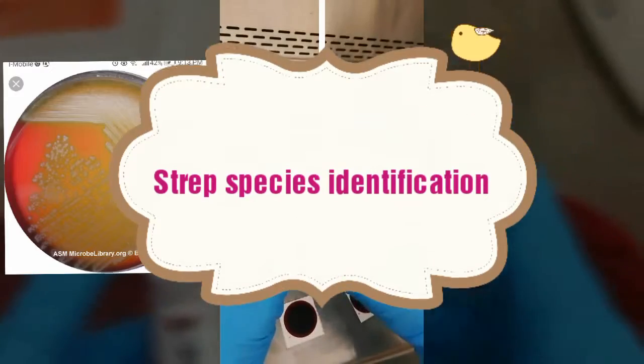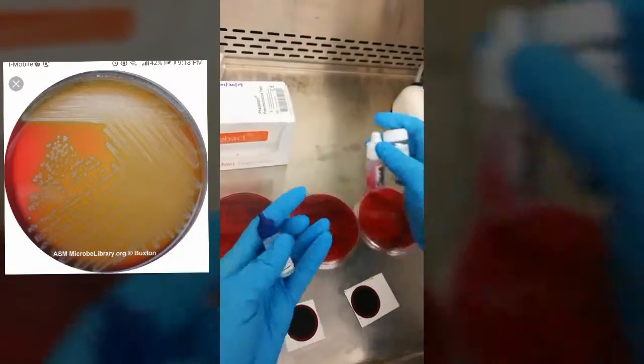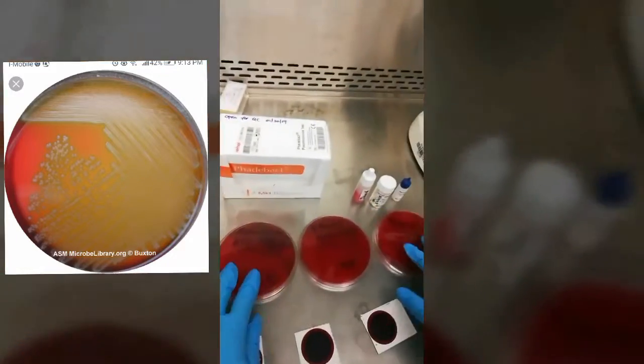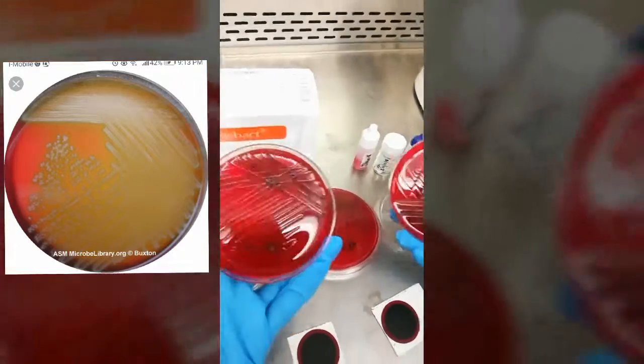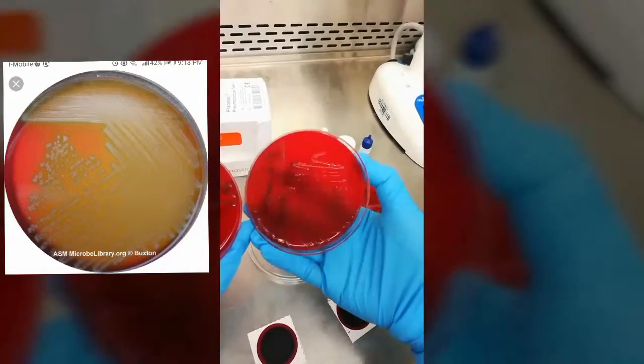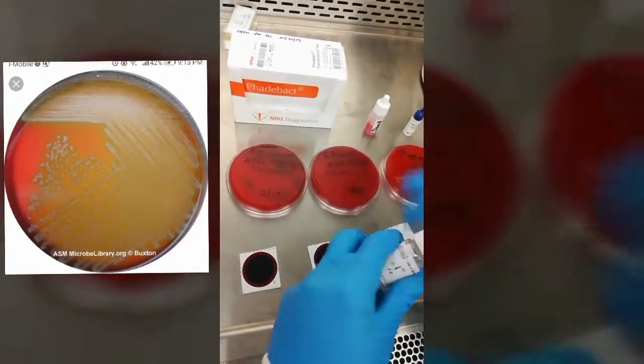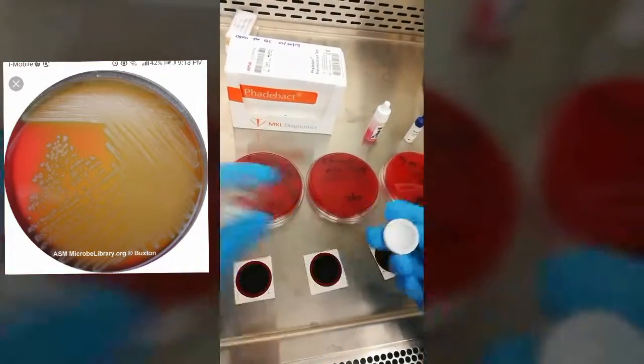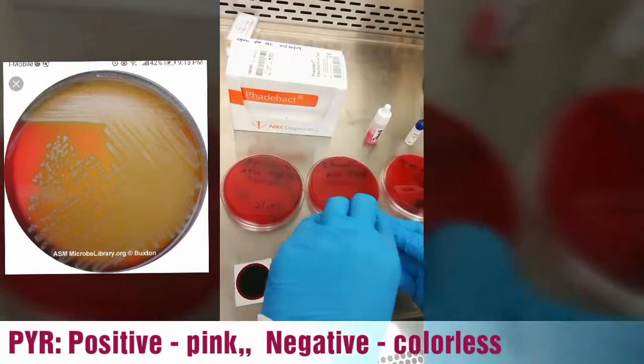Alpha Streptococcus identification method. The biochemical tests for alpha strep include PYR, strep group D test, and pneumoslide. The Gram stain for Streptococcus species is always gram-positive cocci in pairs and chains.